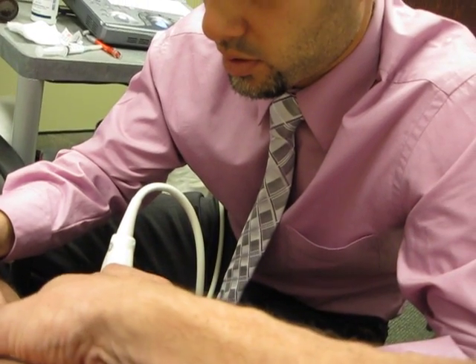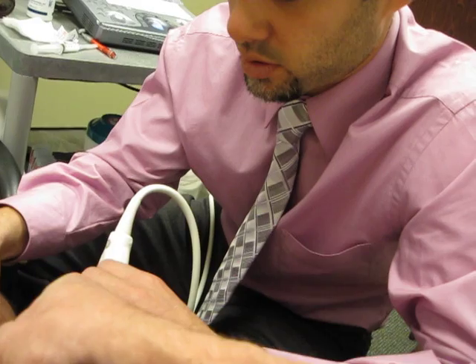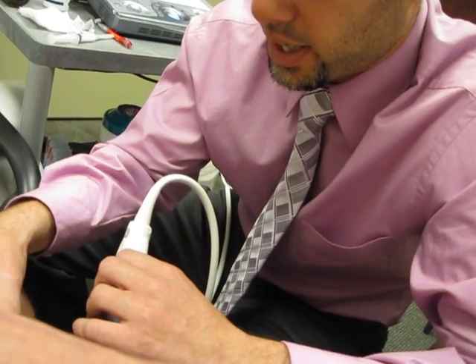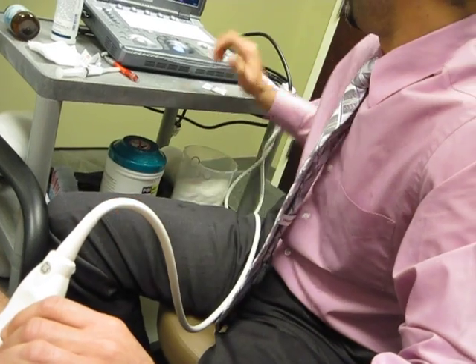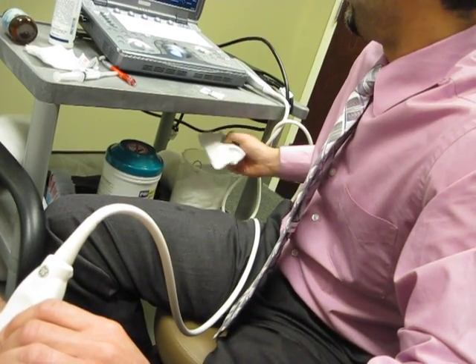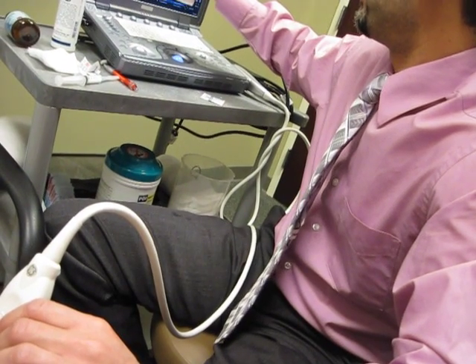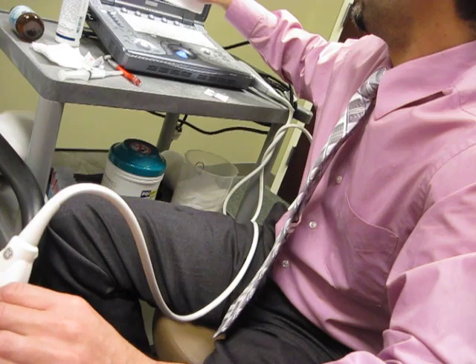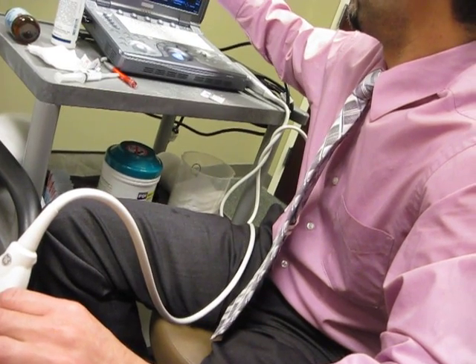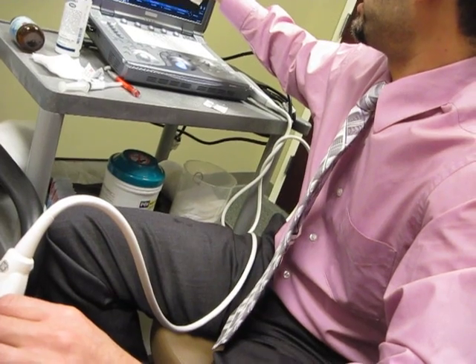Yep. And then point tender is below as well. I can't find it — that's a lot of condyle. So my question is where we put that injection. We can do this. This is where it inserts. And it looks good — that doesn't look bad. It doesn't look like there's a tear.